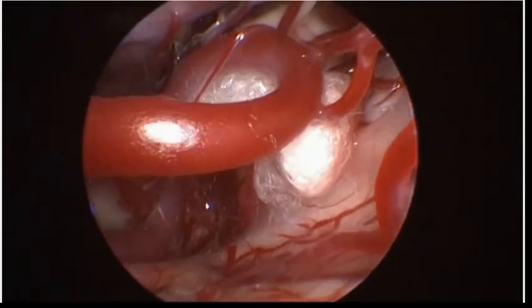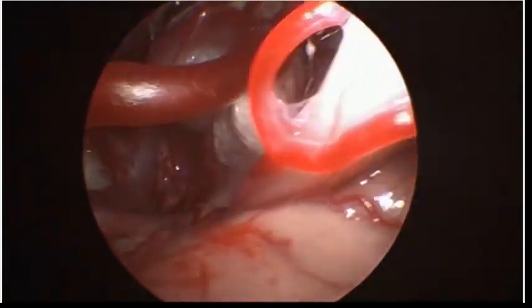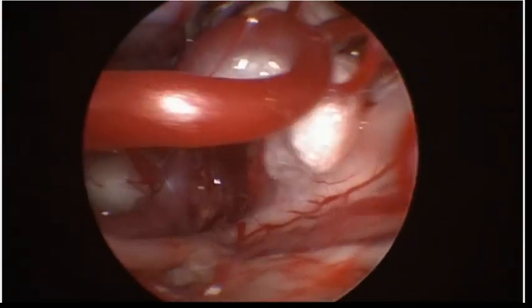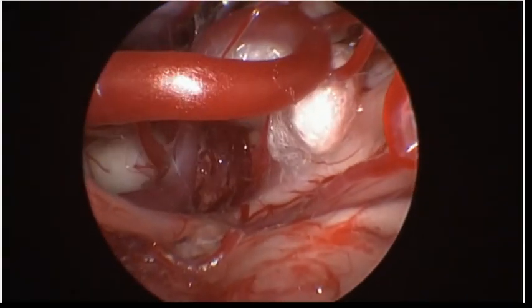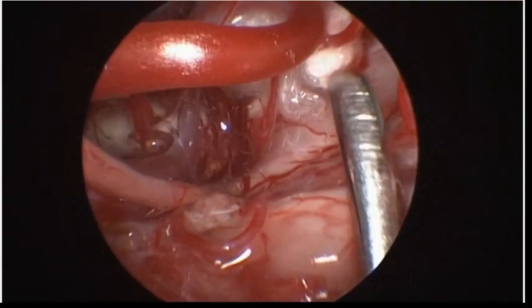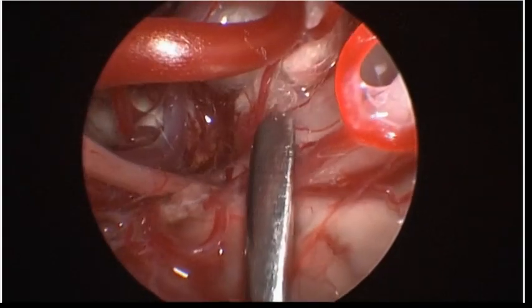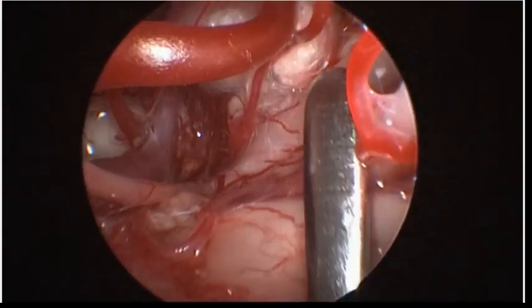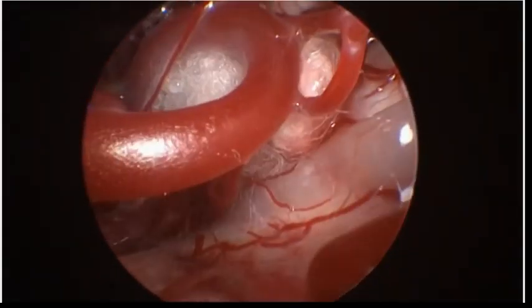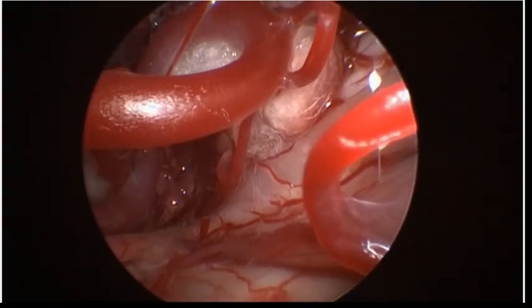After microsurgical insertion of the Teflon, the control of the right position, macroscopic successful decompression, and ruling out of any vascular kinking is performed endoscopically. If the linear view on the compression site is poor, careful improvement of the Teflon position to avoid direct Teflon nerve contact can also be performed endoscopically. Because the endoscope is mainly used for visualization, it is guided by the surgeon itself during the procedure.